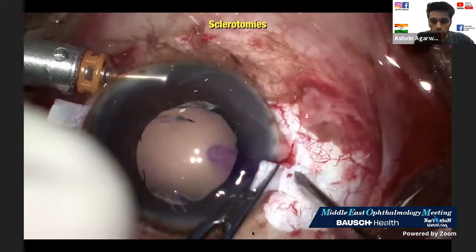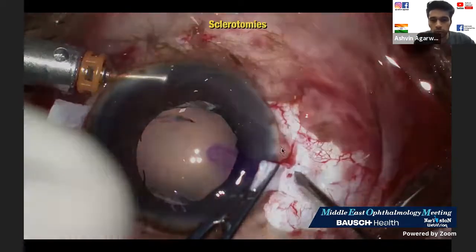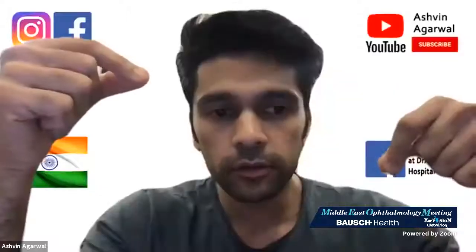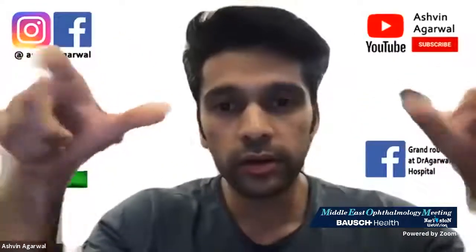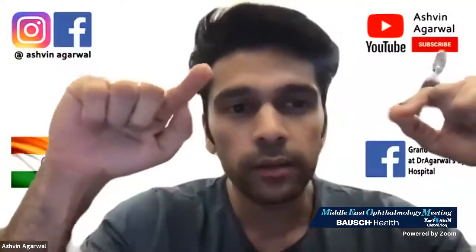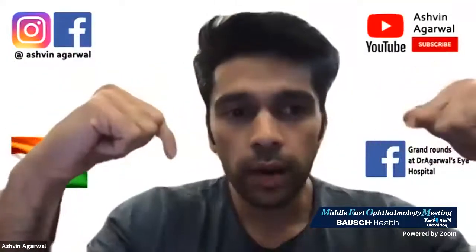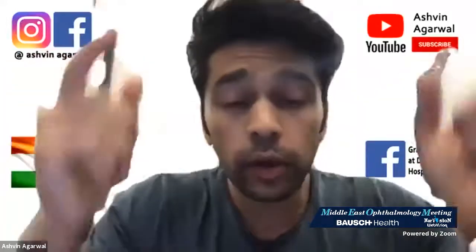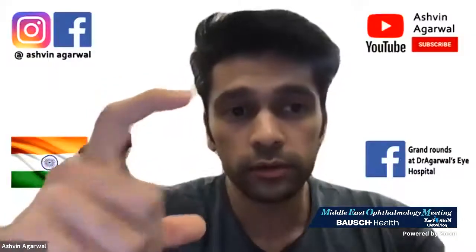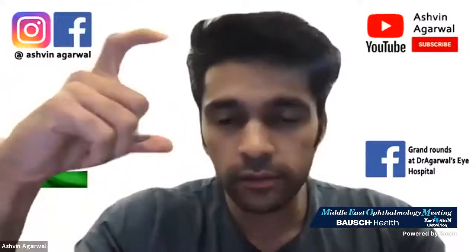I'm just going to unshare my screen because I think it's important I show you. If I externalize both my haptics, if I have a longer distance from the limbus, I will have very short haptics to tuck in the scleral tunnel. If I have my haptics coming out of the sclerotomy, even 0.25 will make a huge difference to the externalized haptic.